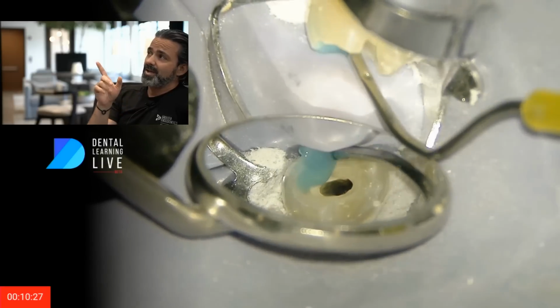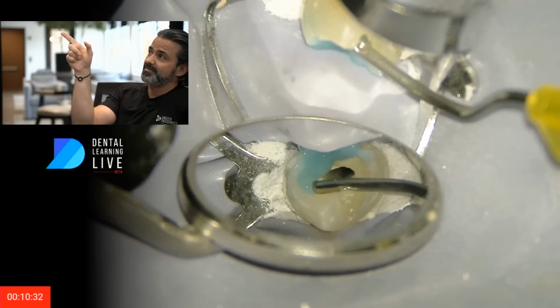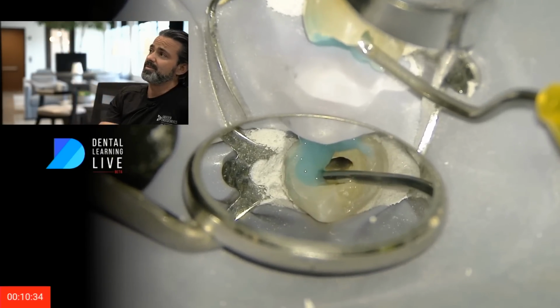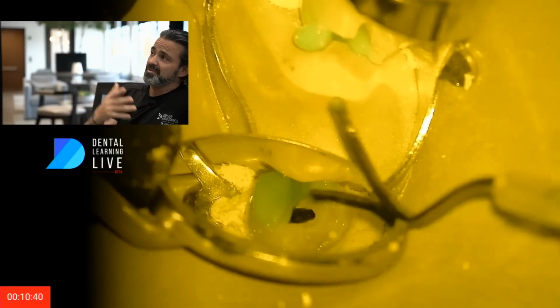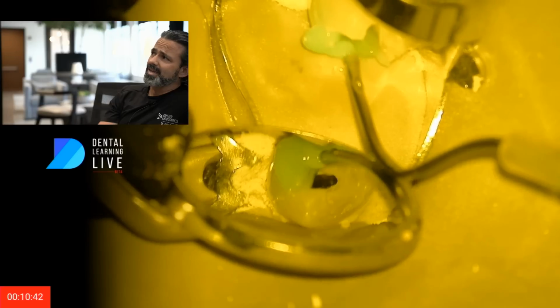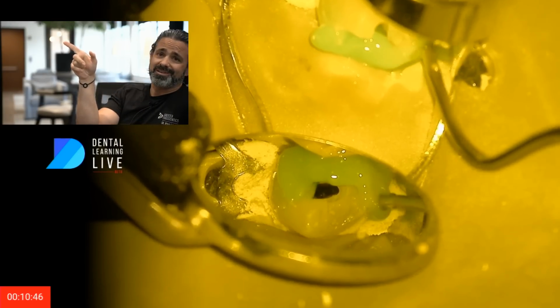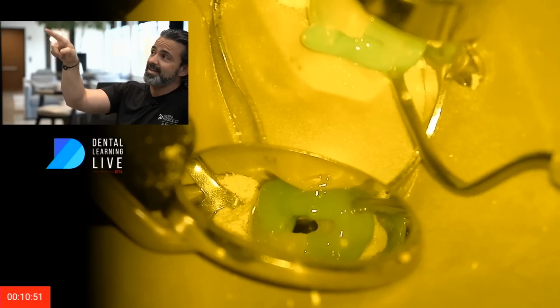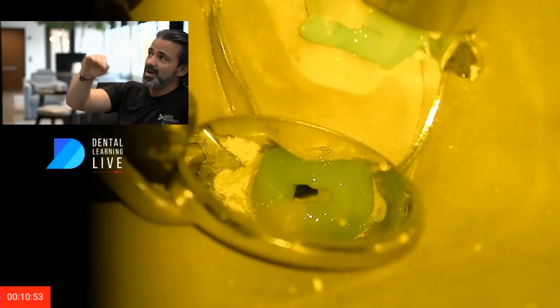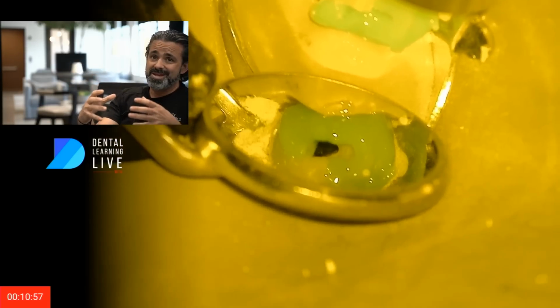And now I've kind of modified the sound seal, because I got my own little tip here that's been pre-bent. This tip is actually used with astringent around the gum tissue, like if you have bleeding gums. I've just taken the tuft out of it, and now I'm using that with my sound seal, because that sickle shape allows me to kind of paint it in, as you're seeing, and paint it around the interproximals, just so I know that when I set that matrix on it, it's going to work.